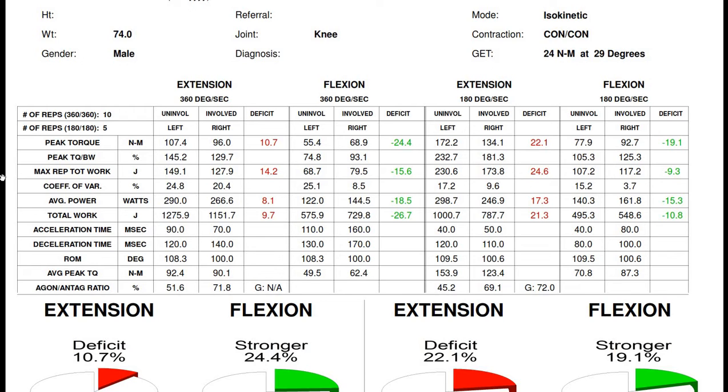The best thing to do is simply to make sure that the test is performed in as effective a way as possible, to make sure that we cover all the points that we covered during the practical session. As long as you've done everything you can in the setup, then that's the main thing to focus on. Then you can start to rule out, well, did I set the chair up right?